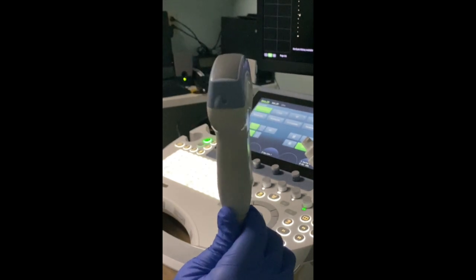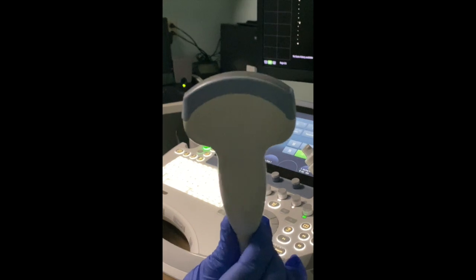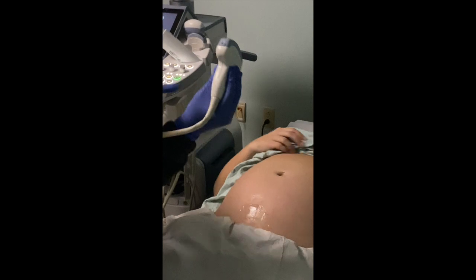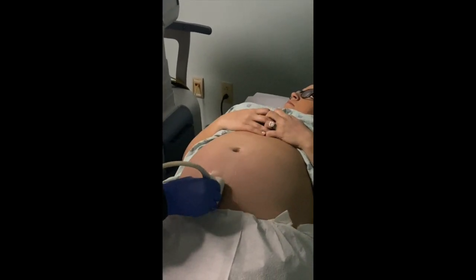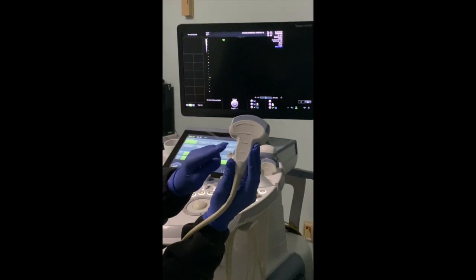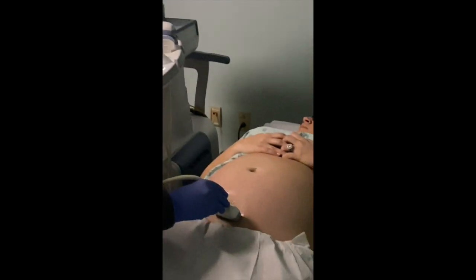Today, we'll be using B mode and pulse Doppler mode. B mode stands for brightness mode, which is your basic 2D obstetric ultrasound image. Remember, each transducer has a probe marker to help identify its orientation. The convention is for the probe to be facing the fundus in sagittal orientation and facing patient right during transverse orientation. You can move from sagittal to transverse by turning the probe 90 degrees counterclockwise. This will allow for correct orientation on the monitor as the probe corresponds to the left side of the screen.